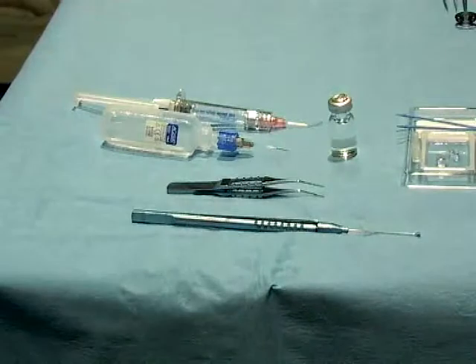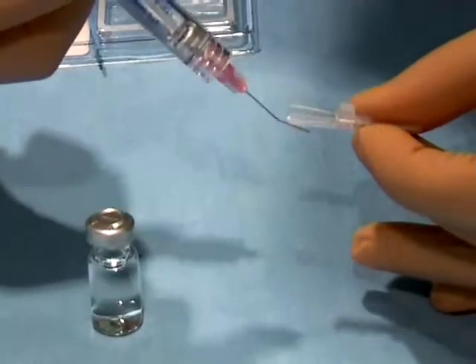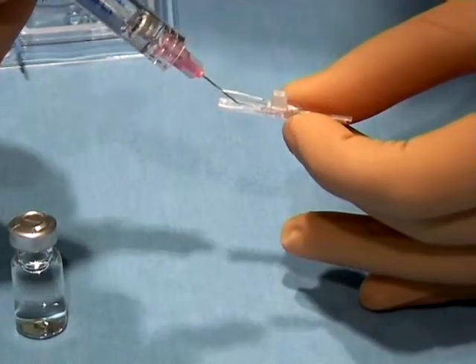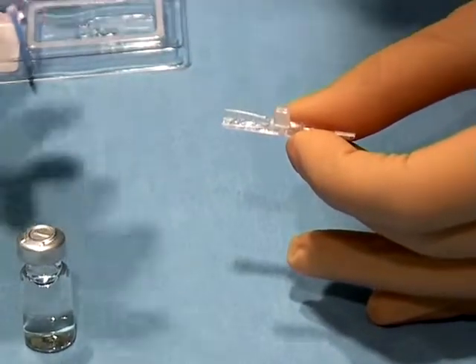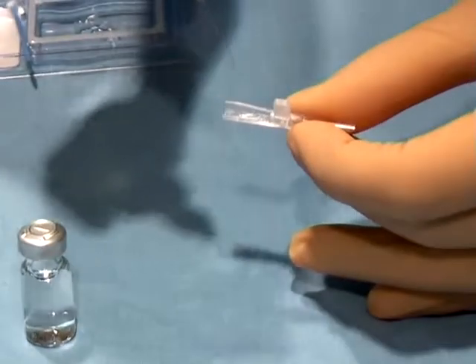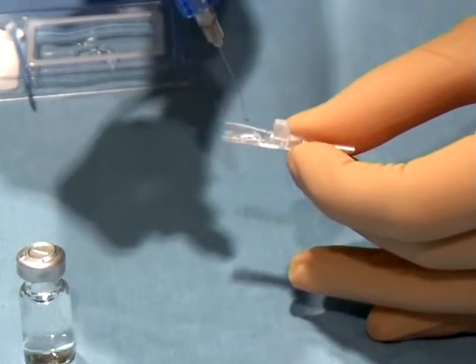To perform toric ICL surgery, only few instruments are needed. The first step is to fill the cartridge with methylcellulose. Be sure not to overfill the open end of the cartridge. This space is filled with a few drops of BSS.